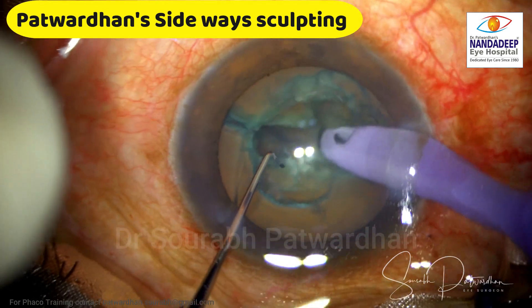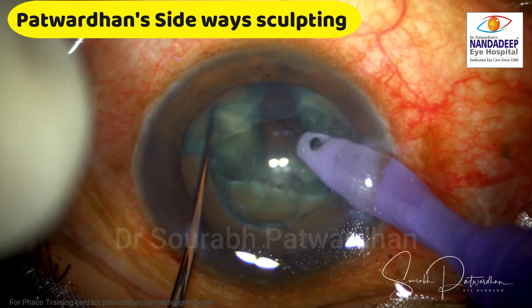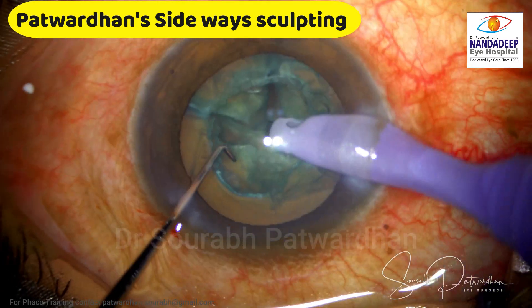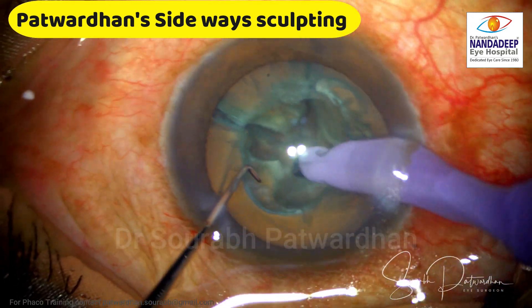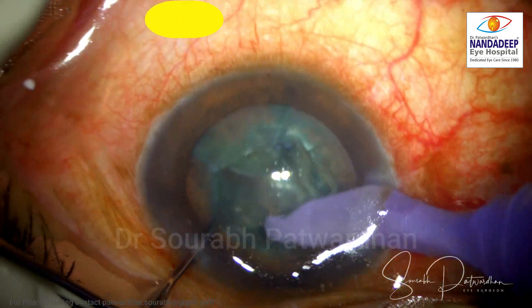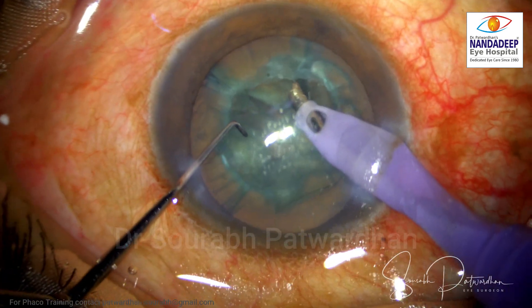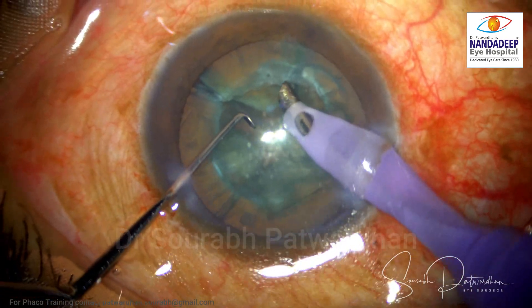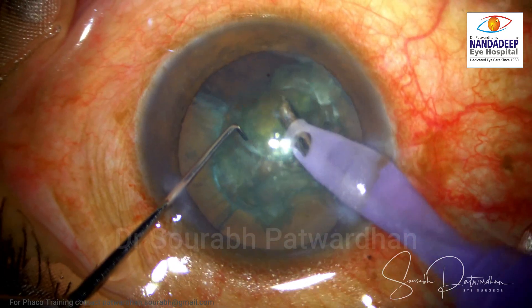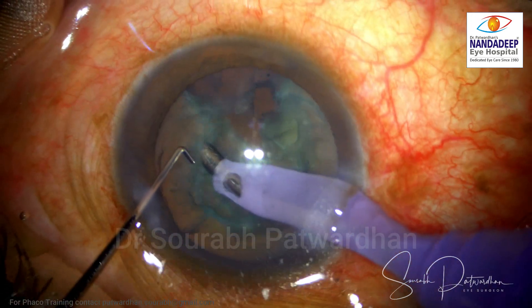So I go to Patwadan's sideways sculpting method. This is the method I use for grade 2 to 3 cataracts with posterior polar, where I do sideways trenching and then divide the entire nucleus into four quadrants. And then I try to take out one quadrant at a time. As you can see, this particular quadrant was free, so I could remove it very easily.